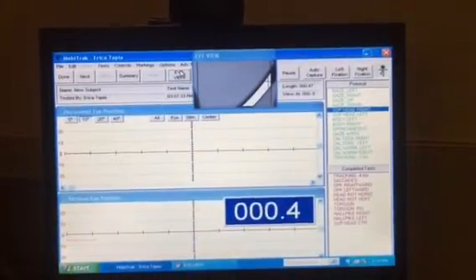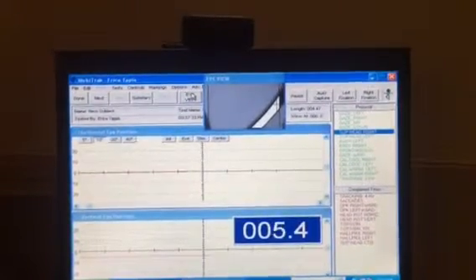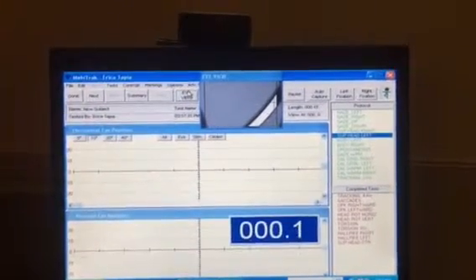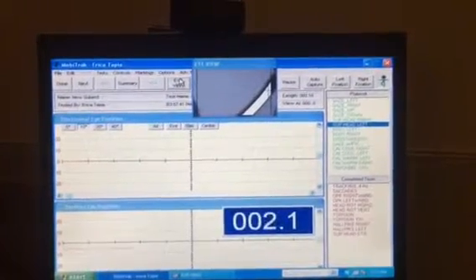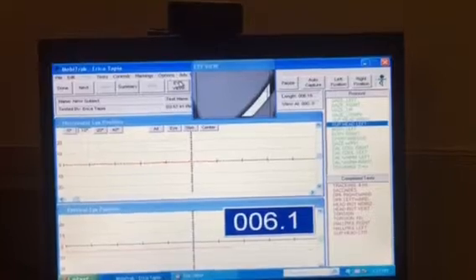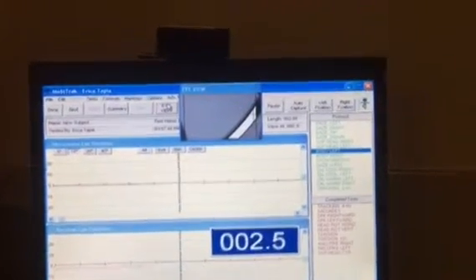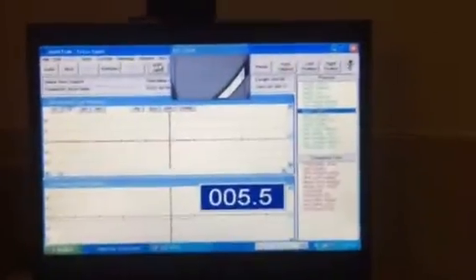Head looks to the right. Just turn their head to the right a little bit. 30 seconds, 25. Head goes to the left. Same thing. Then body left. The head's already there. Follow it with your body. What you're doing is you're putting the ear canal in certain positions.